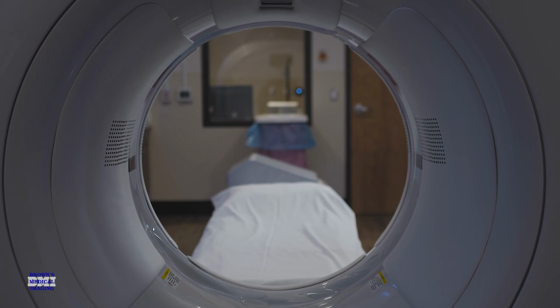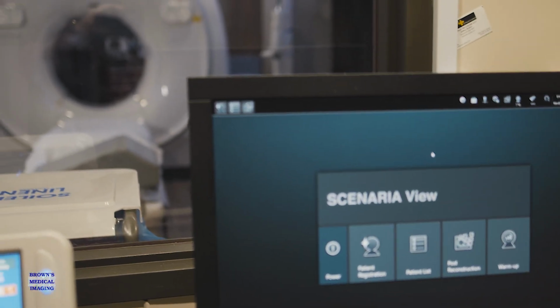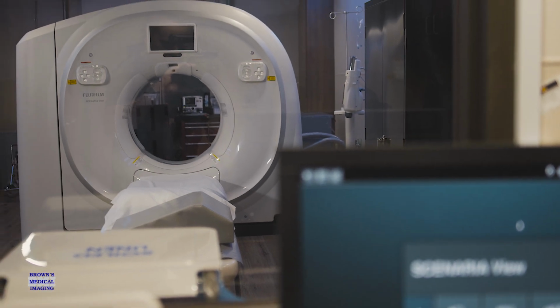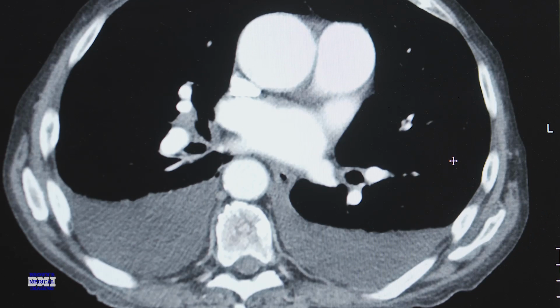The advanced capabilities of this machine allow us to do better diagnostics, cleaner pictures, cleaner images. With our hospital taking patients of size, upwards of 500 pounds or greater, that table will hold a 550-pound patient, and that'll keep us from having to ship that patient out if they needed a CT. We have had a few very large patients. They do not touch each side.